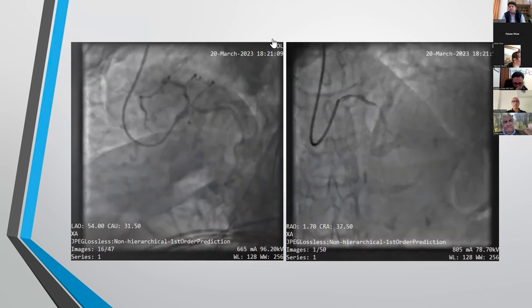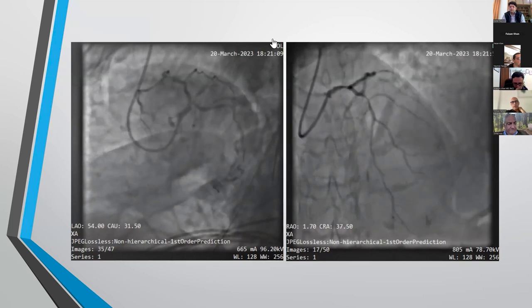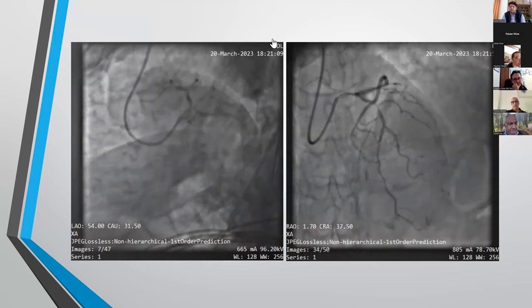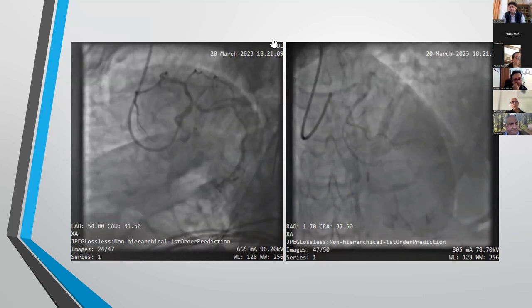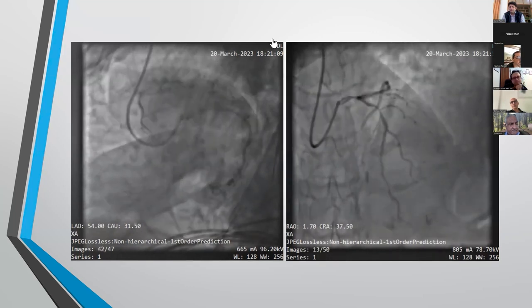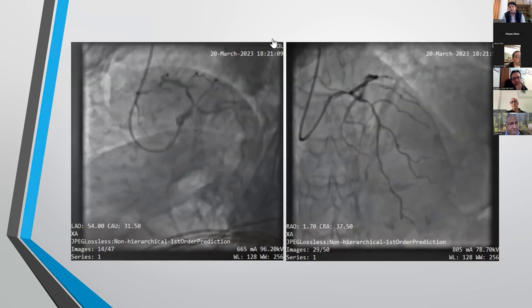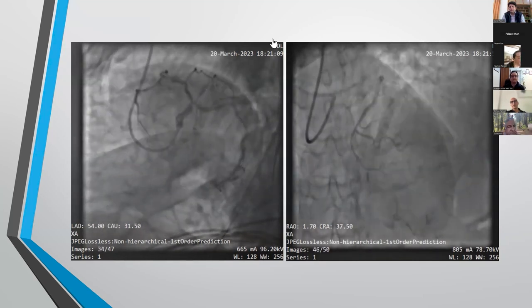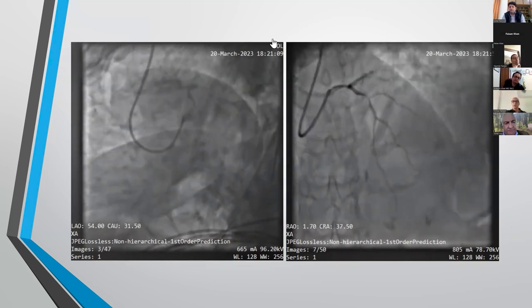Usman, what approach do you use when you're doing stent sizing with IVUS? Thanks, Raman. I think you've gone over all the essential points. I try to use EM to EM most of the time, and then go 0.5 millimeter less than the EM measurement. That's just generally what I've standardized to. Sometimes the EM is hard to identify, either because of the quality of the IVUS image, or there's calcium, or the plaque morphology is such that you don't see it. Then you can do vessel to vessel.